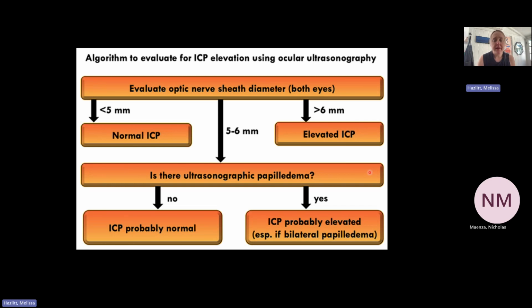Also, in some places where you don't have any access to CT scan and you're working on getting a transfer, you can also look at serial measurements. And in seriously resource poor settings, I'm sure I've told Nick, but I know of people in conflict areas who are using this to help guide their triage of who they're going to work on extricating from field positions to the hospitals and to more definitive care.